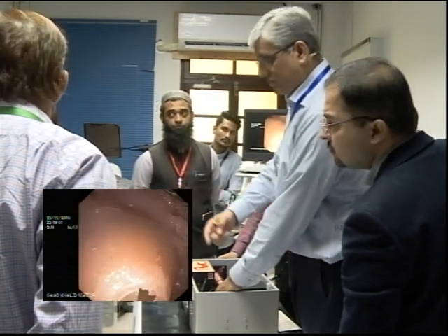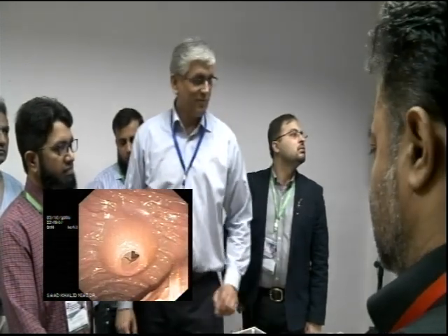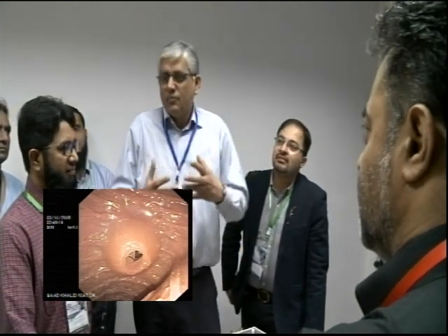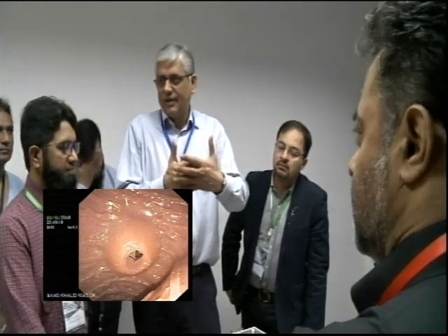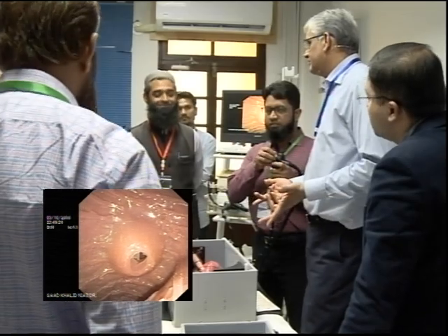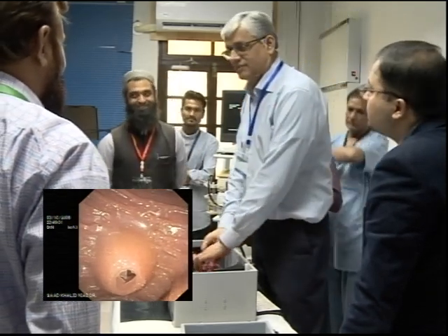You just mentioned one thing before we proceed. We don't like the word pushing. Why do we say pushing is not good? Perforate? Yes, but pushing means you're actually advancing against resistance. And in endoscopy, if you are advancing and there is resistance, you stop, if you want to avoid perforation.